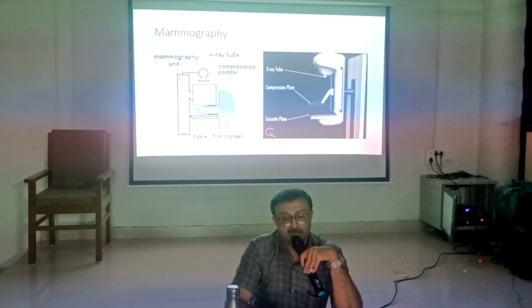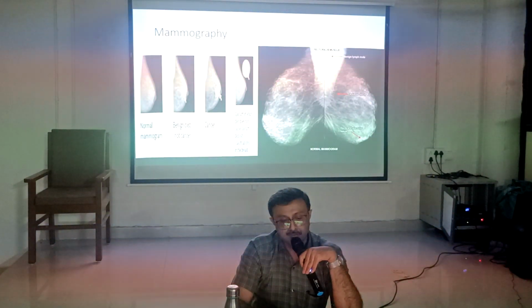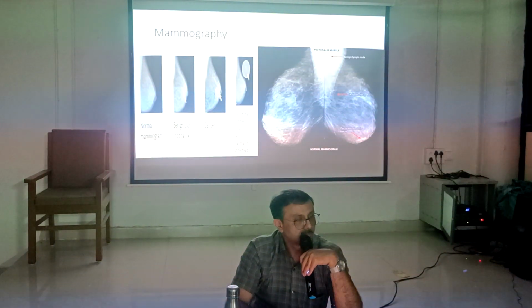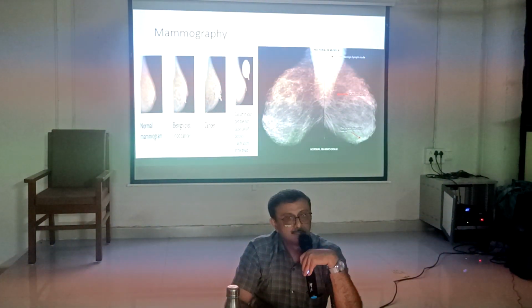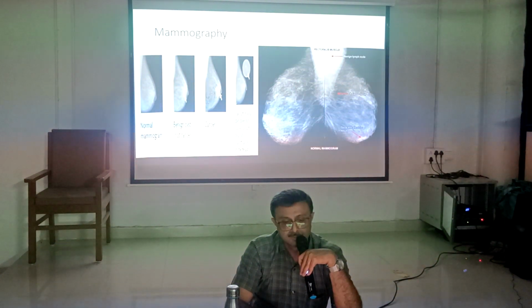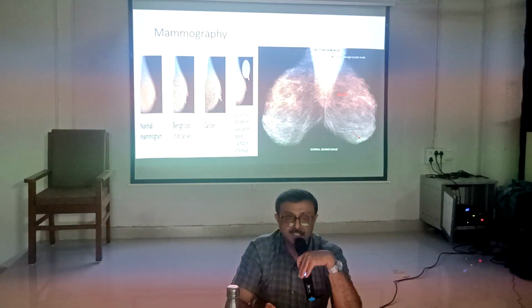So, what are the projections? Craniocaudal and mediolateral oblique. Which projection covers the largest volume of breast?